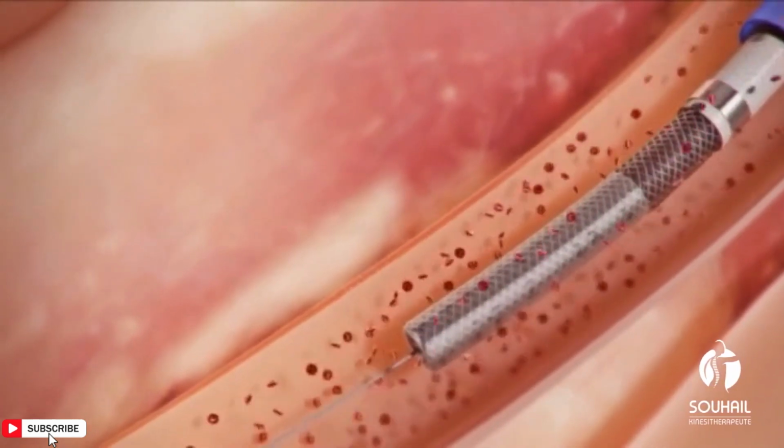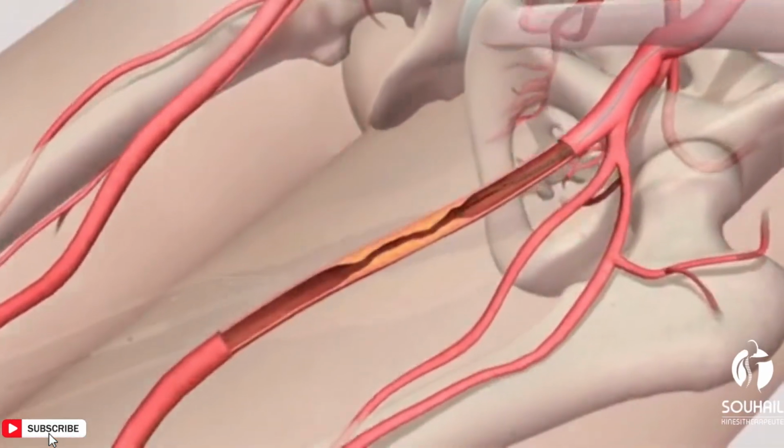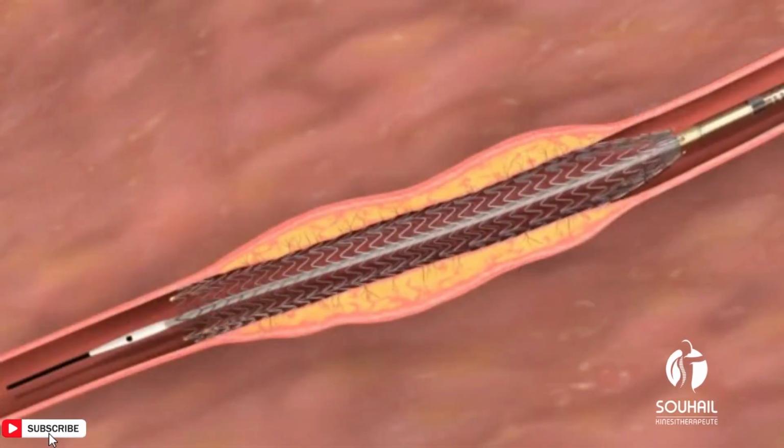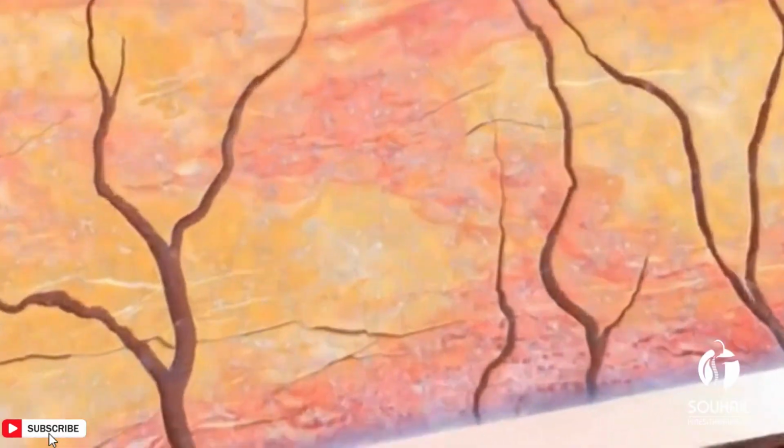Stent placement. If necessary in some cases, a small mesh tube called a stent may be inserted into the artery to help keep it open. Stents are often used to prevent the artery from re-narrowing (restenosis) after angioplasty.